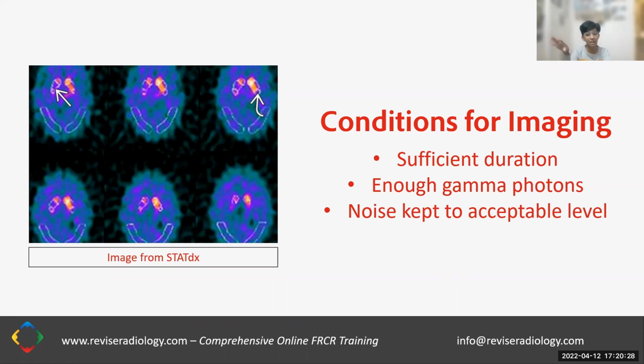So the examination time has to be of sufficient duration that we're able to catch enough gamma photons to create a good image. And this is especially important because this is a high noise type of imaging. So the way that we keep the noise to an acceptable level is by picking up enough gamma photons.